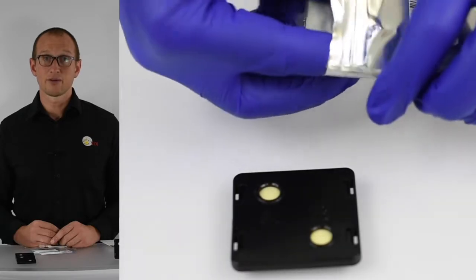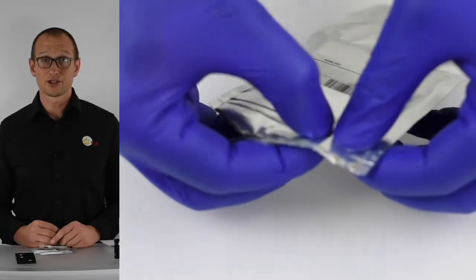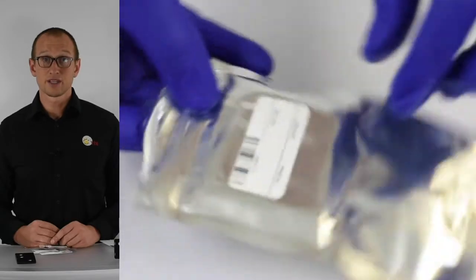Immediately place the dried serum device back into the foil bag. Do not allow to air dry. Make sure the zip seal is closed tightly.